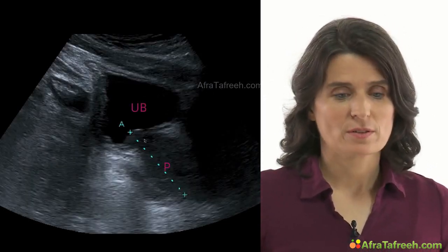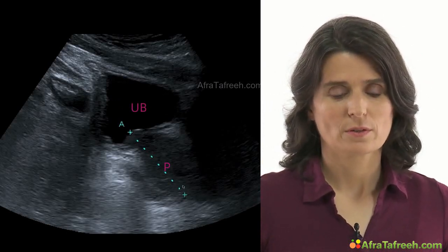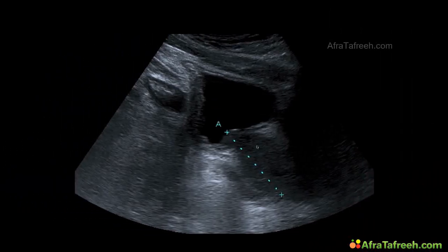The same patient in a longitudinal scan, also in the longitudinal, in the cranial caudal diameter, we got an enlarged prostate over here. So important is to remember that when you encounter a patient with a hypertrophic prostate, we always ask them if the condition is already known and if they have a regular checkup at the urologist.